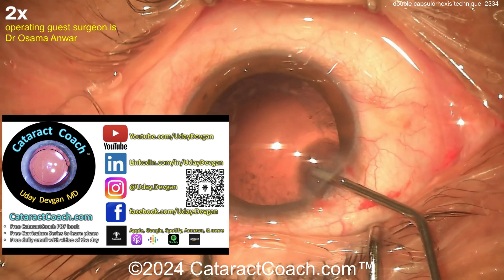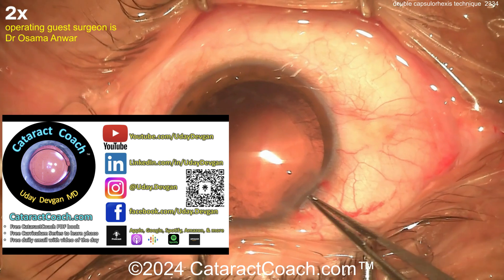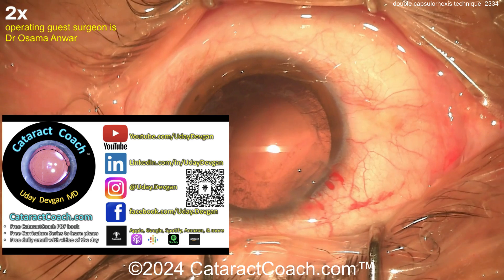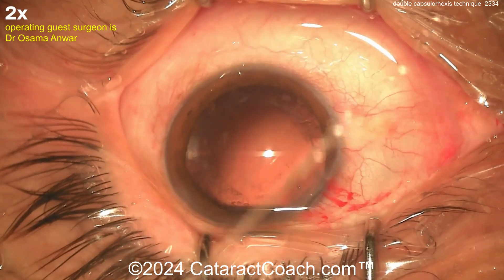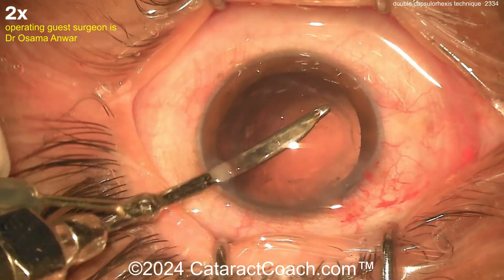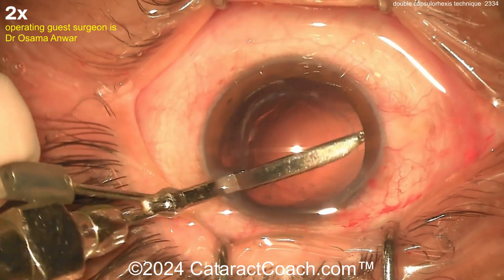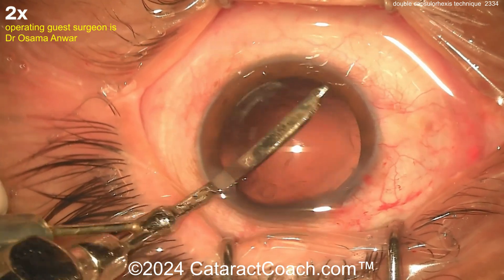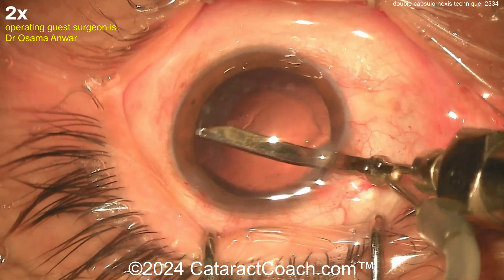Let me tell you about the top podcast in all of ophthalmology. Every Sunday we've got an hour episode interviewing a guest with the sole purpose of making you a more successful ophthalmologist — it really is that good. Available everywhere. Now, using the Simcoe cannula again — cleaning out that capsule bag. Sometimes with white cataracts you can't get out all the lens material; sometimes there's some fibrotic stuff stuck to the posterior capsule. That's okay too.